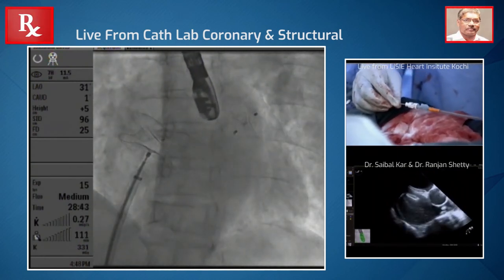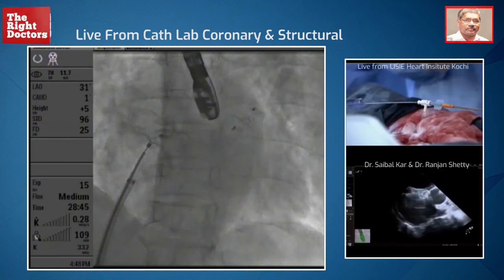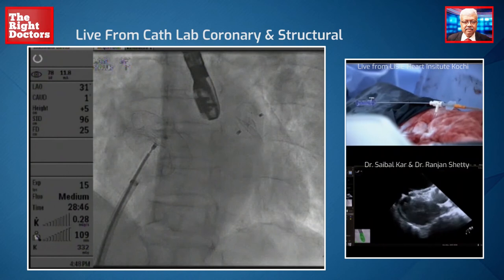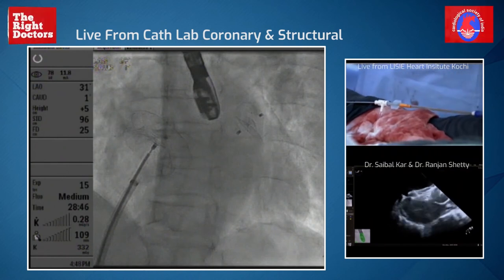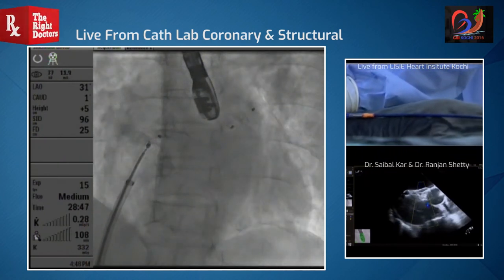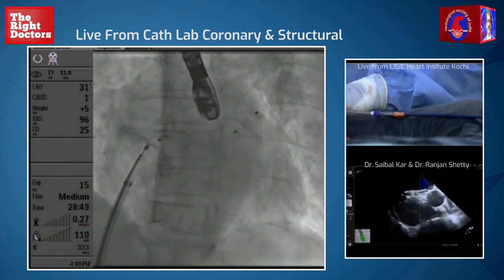I think we got it — I think it's good, it's perfectly done. Can you see that? So we've nicely covered the left disk at the right disk, and it's not oversized — you see that? It's not flattened. You guys have got a good choice of device. Edwin, you did a very good planning of the case — all credit to Edwin.